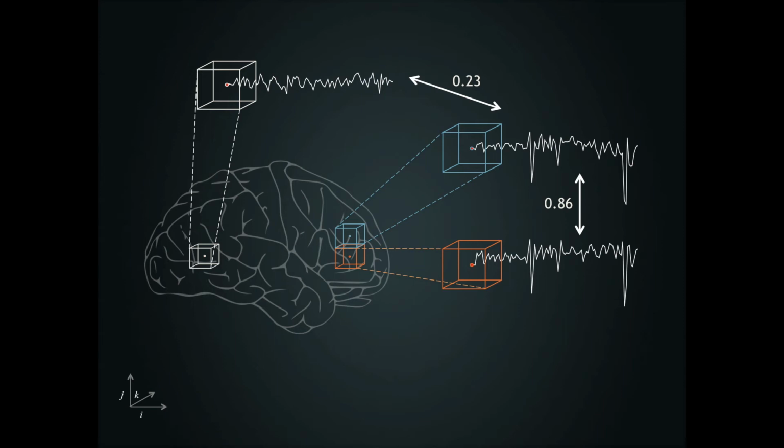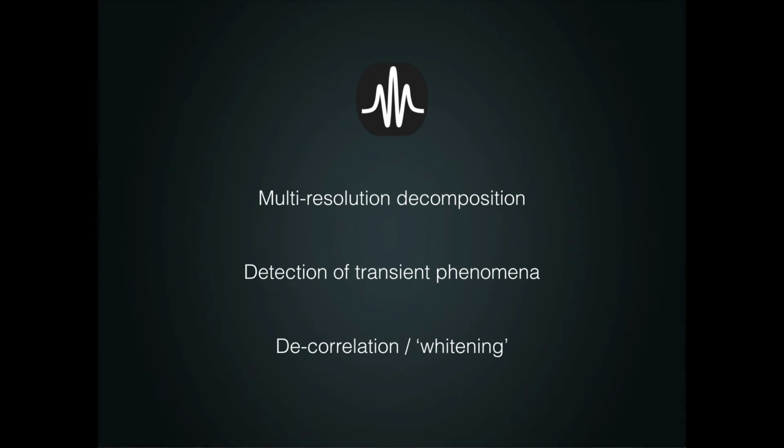And this leads me on to wavelets. So why are wavelets particularly good for solving this type of problem? Well, wavelets are useful for fractal and 1/f or long memory processes, both of which apply to functional MRI. They provide multi-resolution decomposition of signals and are good at detecting transient non-stationarities. If one were to use a Fourier transform on a spike, you'd end up aliasing the spike into other frequencies, because the Fourier transform fits a set of sinusoidal bases to the spike, which of course doesn't fit the profile of the spike at all. So the Fourier transform of a spike is white.